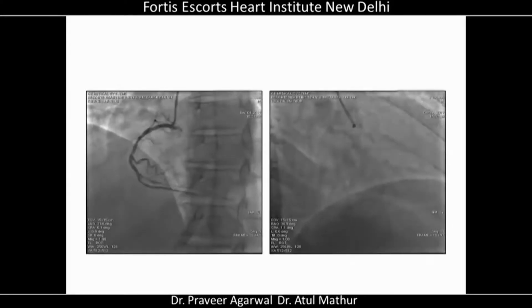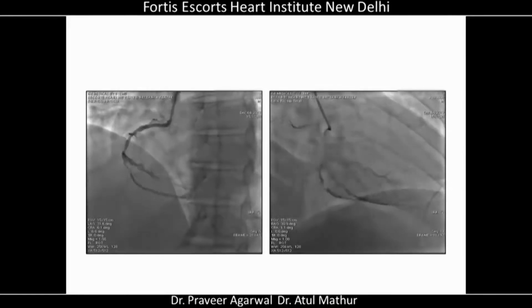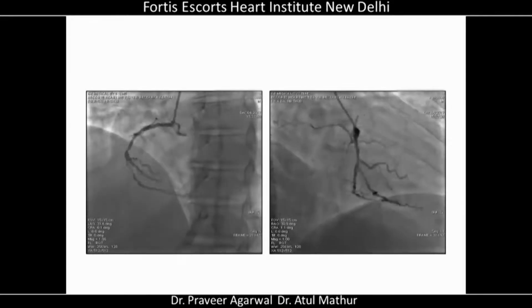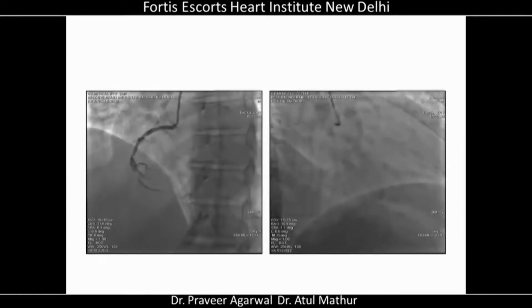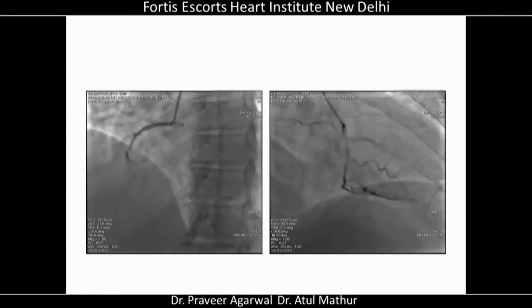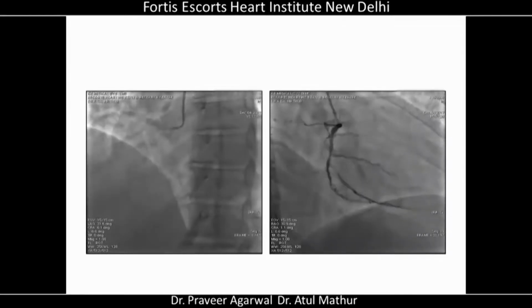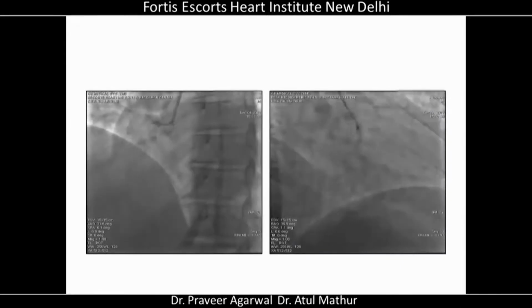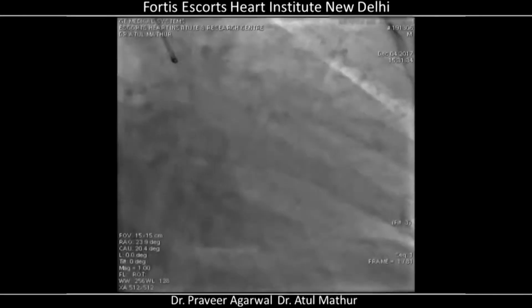The right coronary artery has an early bifurcation, and there is a tight disease in both the PDA and the PLV. And there was a little haziness in the PLV. So yesterday we did this angiography through the radial route. None of these lesions is ostial. So we did a 6 French angioplasty with 1 stent to each artery and let him settle down over the night. So show the next slide.